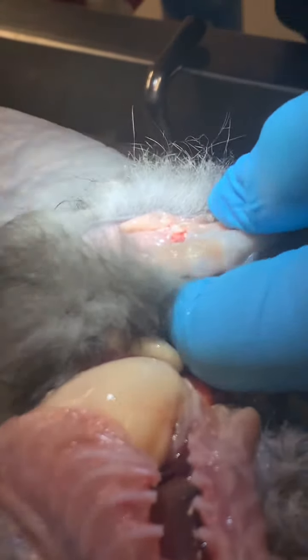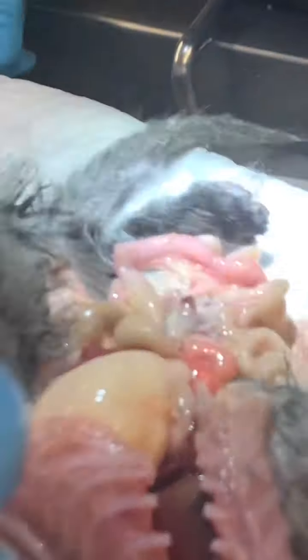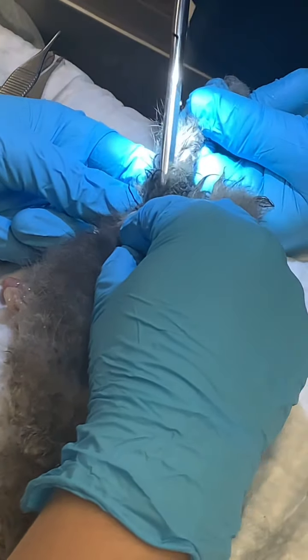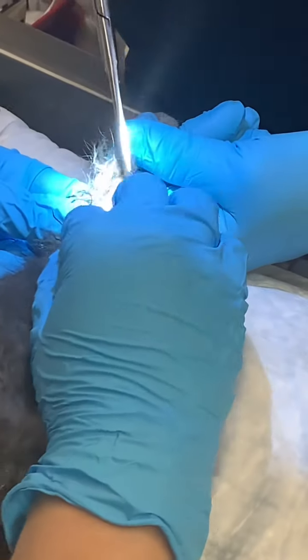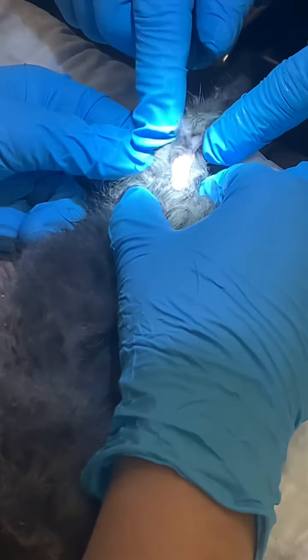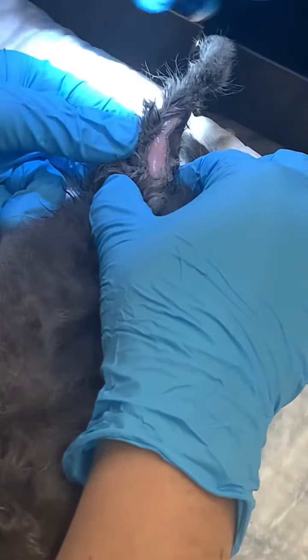Let's go the other side. It should be right back there though. There's his knee. So it should be right in there.